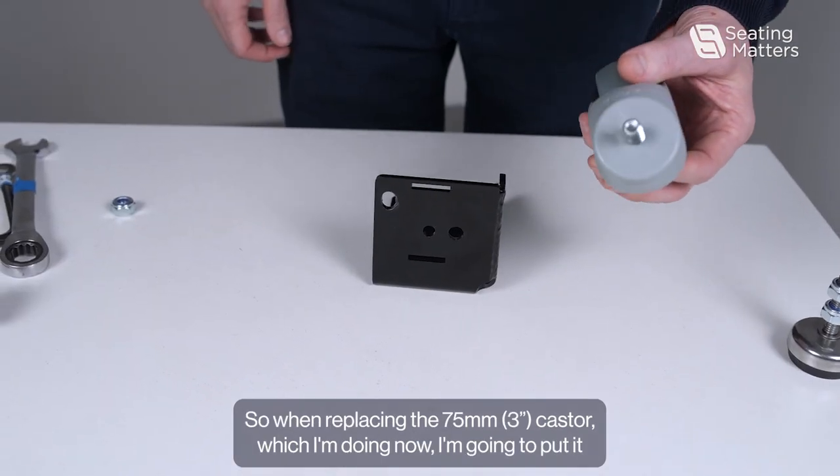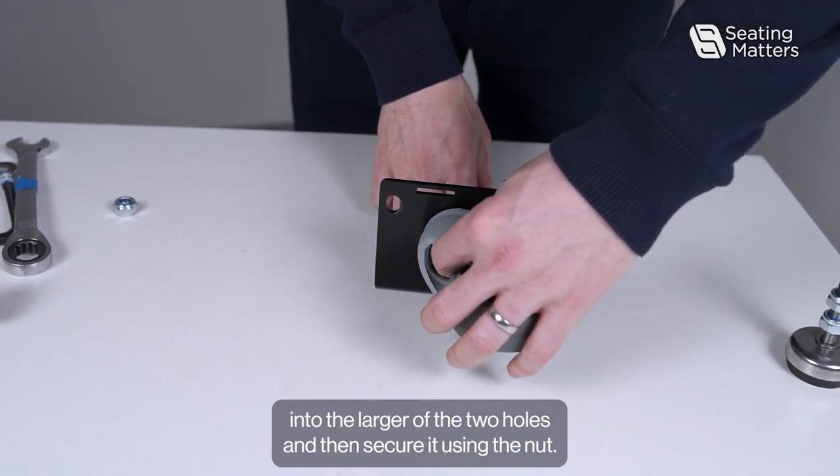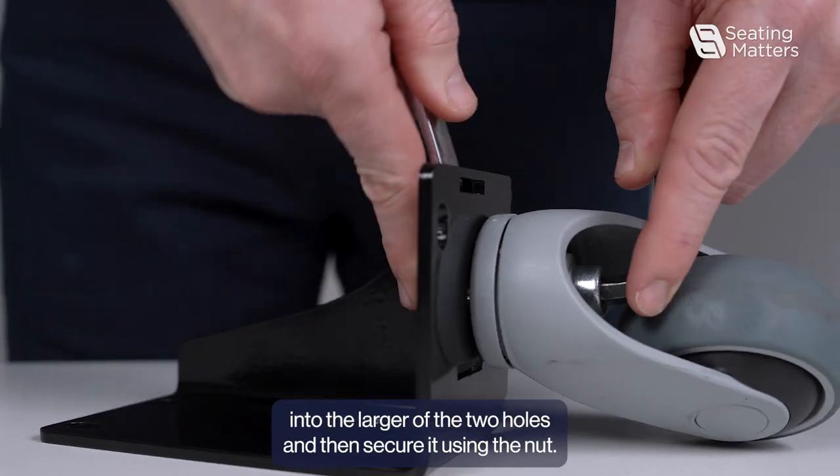So when replacing the 75mm caster, which I'm doing now, I'm going to put it into the larger of the two holes and then secure it using the nut.